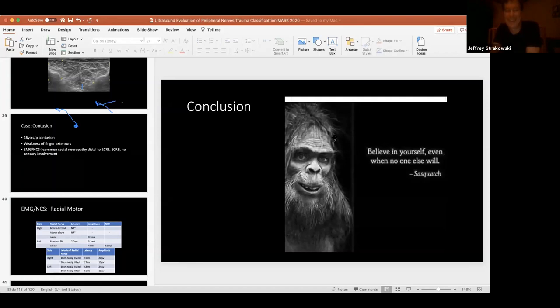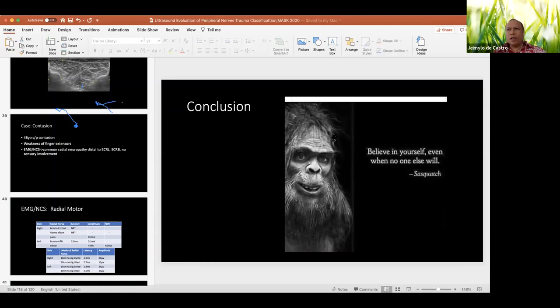My only question is, I was trying to look at the papers regarding the earliest time you can see any changes in the nerve when there is a pathology. I've seen mixed information. Of course, EMG can see changes as early as 3 weeks or sometimes 2 weeks, sometimes 3 days, depending. So it's going to be the same answer: you can see changes with ultrasound and anatomically faster than you can see all of the changes in electrophysiology.